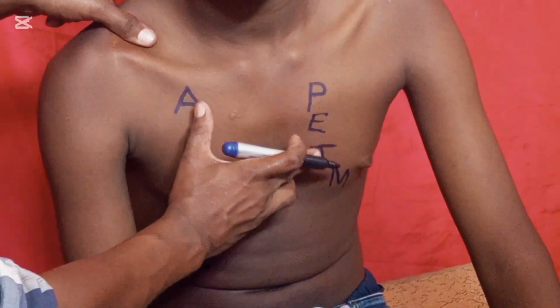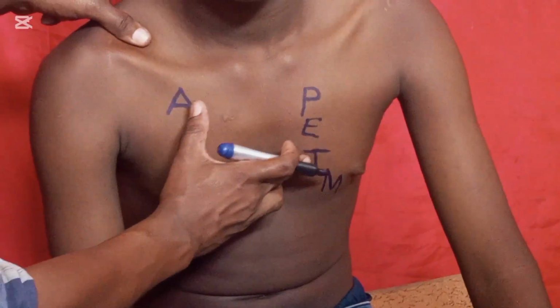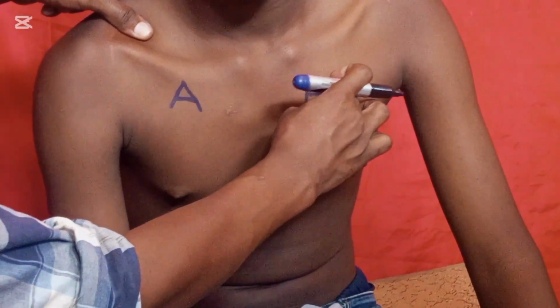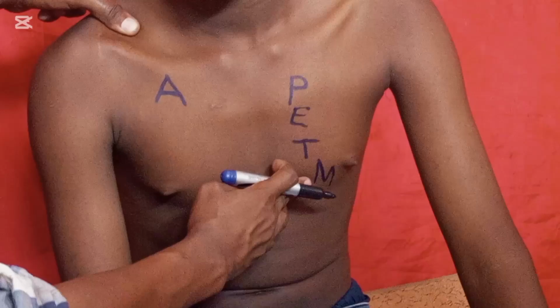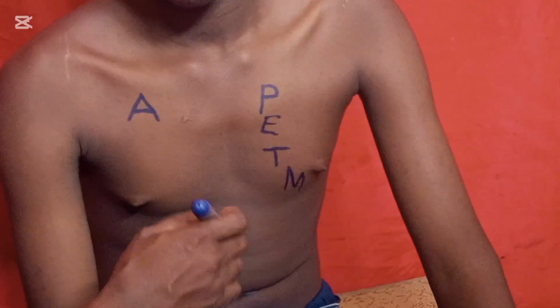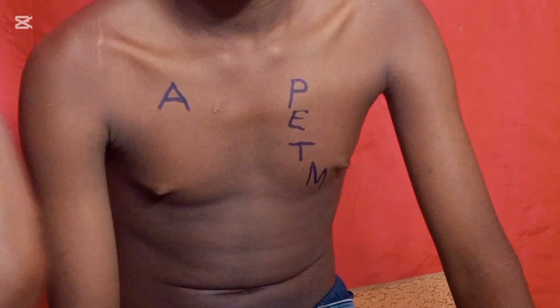Then we move into the fourth intercostal space on the left side of the sternum. So we find here the tricuspid valve. Then in line with the clavicle, we move down. So this is where we find the mitral valve. So this is how you are going to locate the areas where we are going to listen to the heart sound. So now we shall be using the stethoscope to listen to the heart sound.